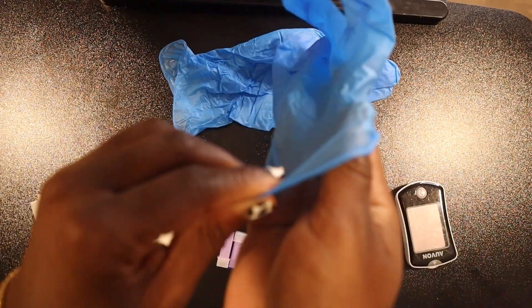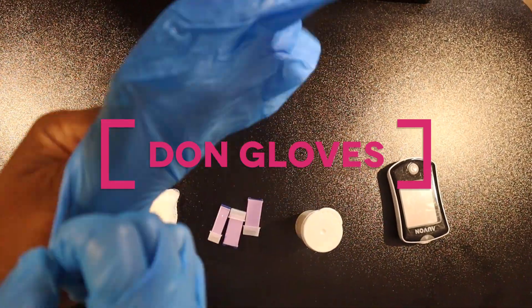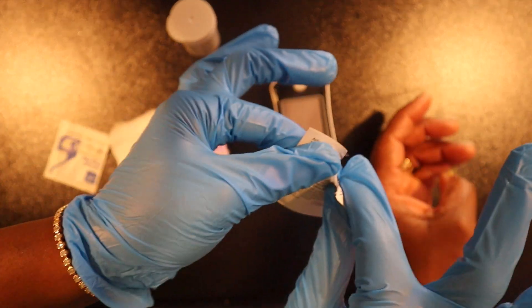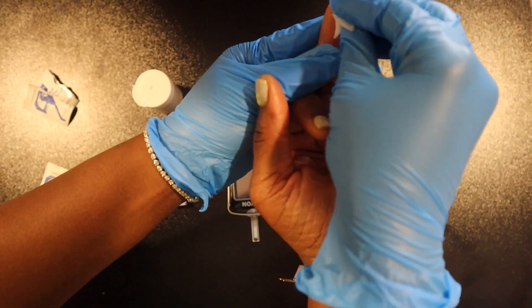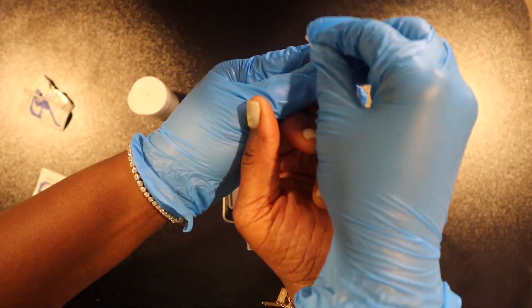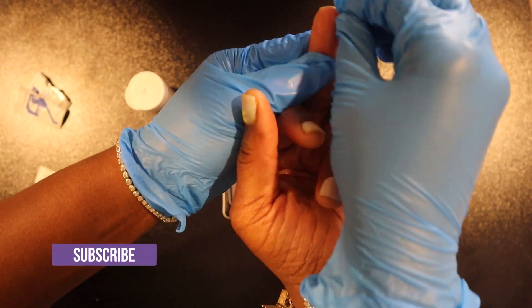Let's put on our gloves and get started. We're going to begin by rubbing the designated finger with alcohol and allow it to air dry. The middle finger and ring fingers are usually the best fingers to prick because they are less sensitive than the index and thumb and leave less calluses and scars.